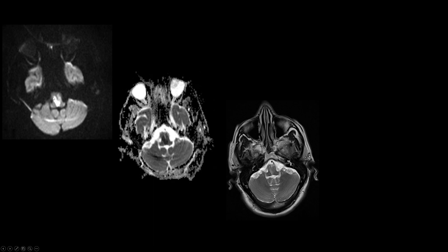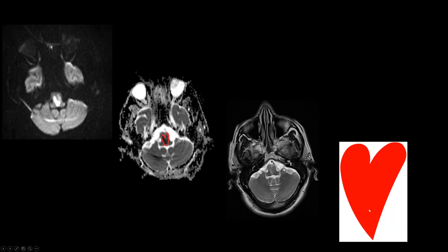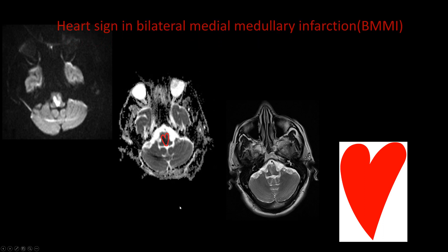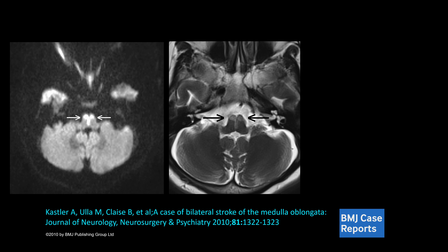Next case: hyperintense areas in the medulla, typically in the paramedian location, showing restricted diffusion on DWI and low signal on ADC. These are typically mimicking a heart — not an actual heart, but somewhat elongated. This is the classical heart sign seen in bilateral medial medullary infarction.